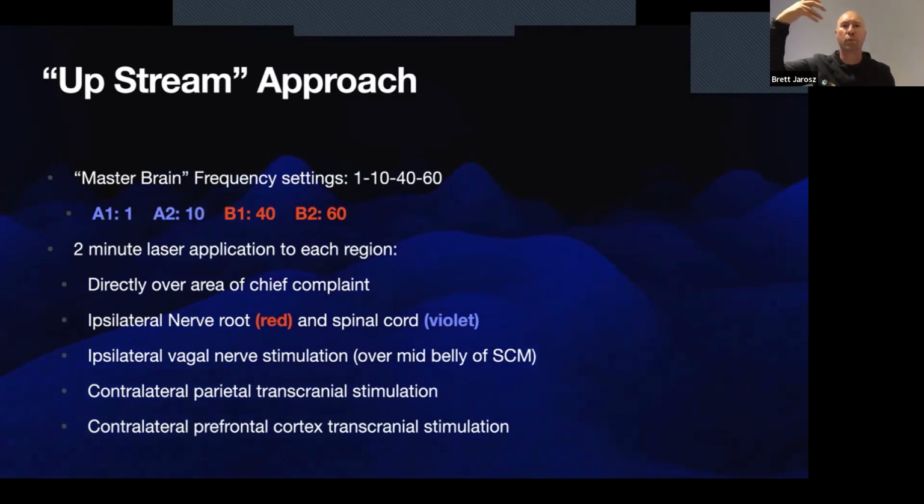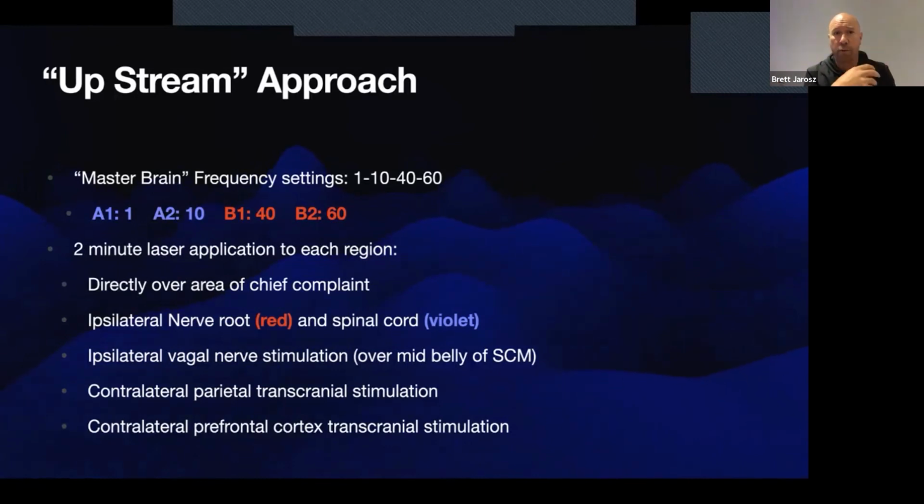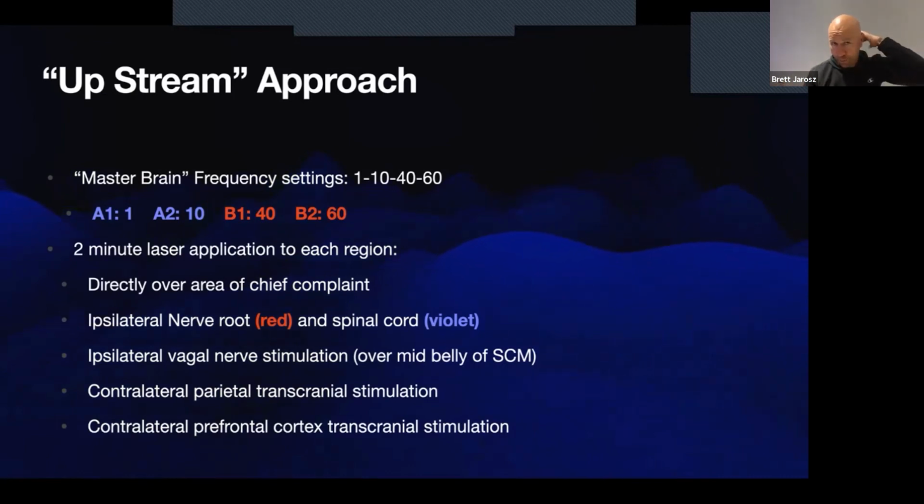So you look at this and you go, well, why are we swimming upstream as it relates to the nervous system? Obviously the local area, the nerve root, of course, because that's where the nerve root is exiting for that area, spinal cord, all of that pain integration. We don't have time to go through the pain modulation, but if we get a chance to do a full weekend seminar coming up, hopefully in the new year, we're going to go through a lot of these details, a lot more practical applications. People are going to get a chance to use these devices and feel those things happen to themselves. Obviously spinal cord, nerve root, stimulating those areas from a pain perspective. The vagus system, the anti-inflammatory parasympathetic effects of the vagus system. I'll share a couple of slides on that coming up.